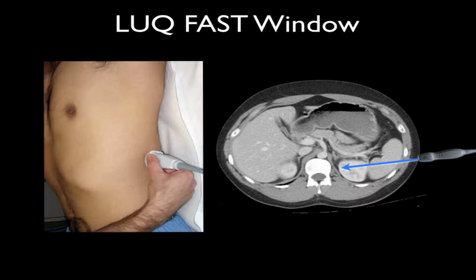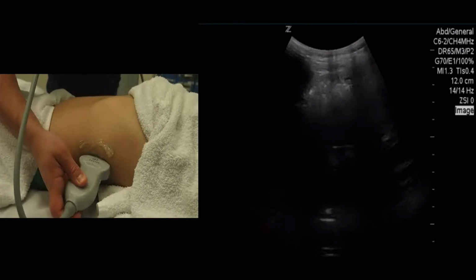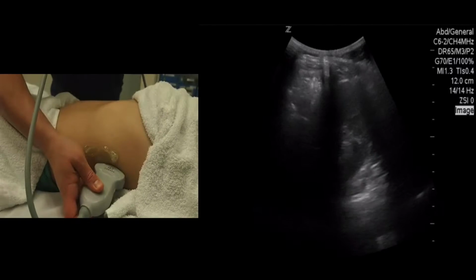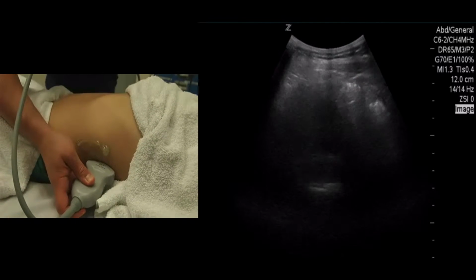If you shoot it anterior towards the anterior part of the abdomen, then you will get stomach and intestine in your view, and you're going to miss that free fluid collecting in the dependent portions. And if you're using a curvilinear probe, or just have a patient with very tight rib spaces, then try to shoot right in between them. And that might mean angling your curvilinear probe between the ribs and changing the angle of your transducer.